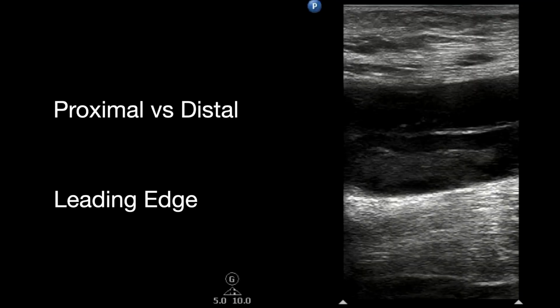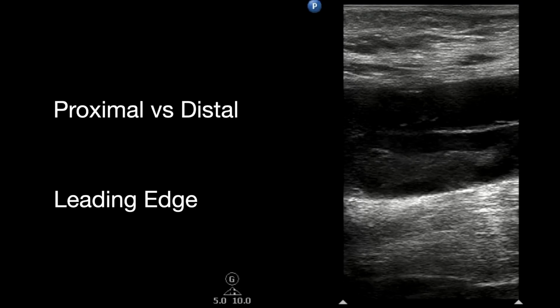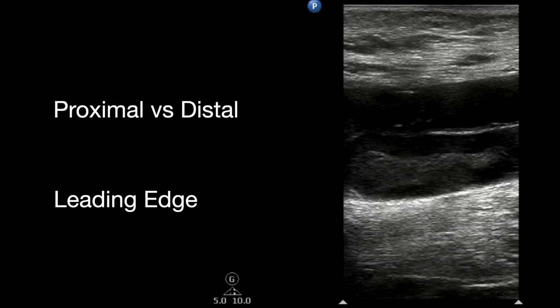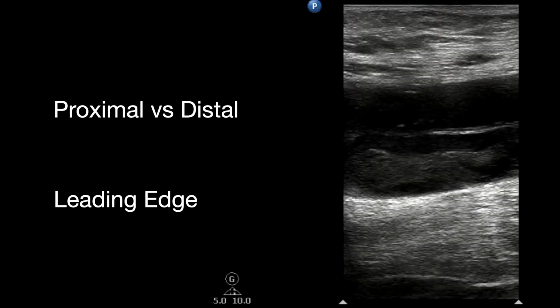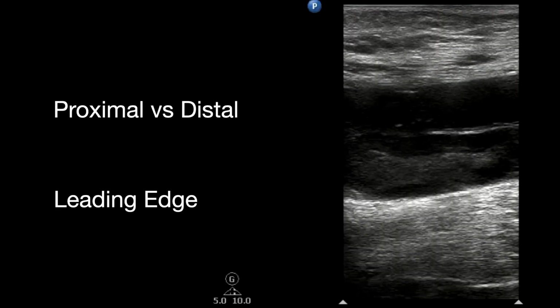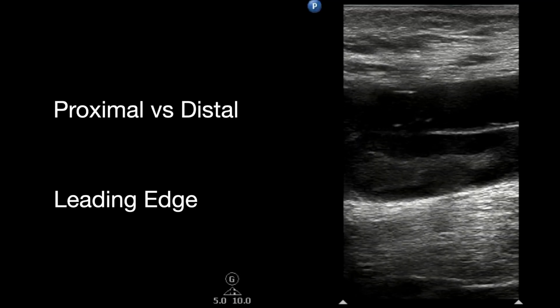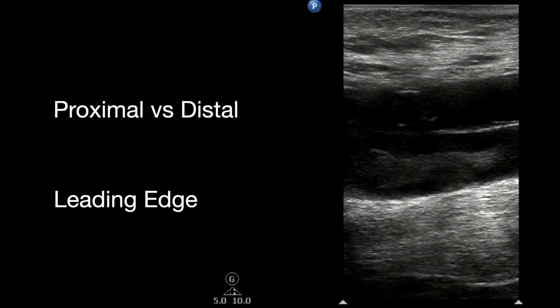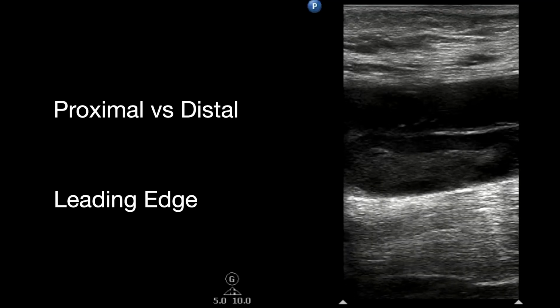And so a similar context would be pneumothorax. It's one thing just to throw the probe on and say there's no lung sliding in this lung, they have a pneumothorax. You're probably not wrong, but not all pneumothoraces are treated the same, right? You put a chest tube in some, you don't put a chest tube in others. And so taking it to the next step is basically saying, okay, yes, I got a pneumothorax, but let me scan above and below and to the side and see how big this thing is, right?